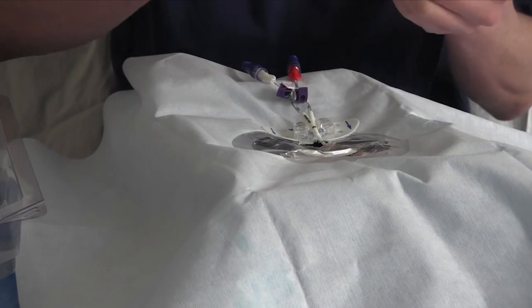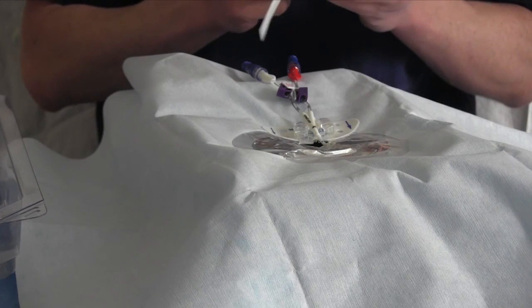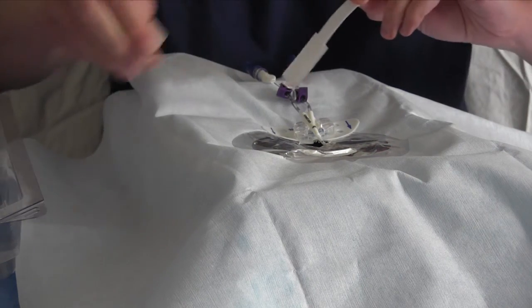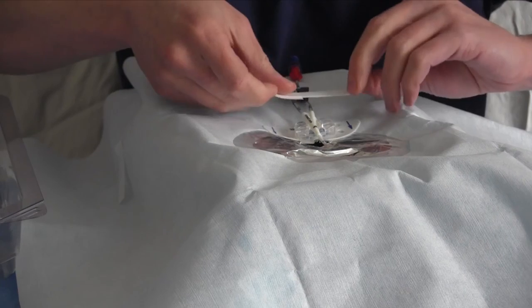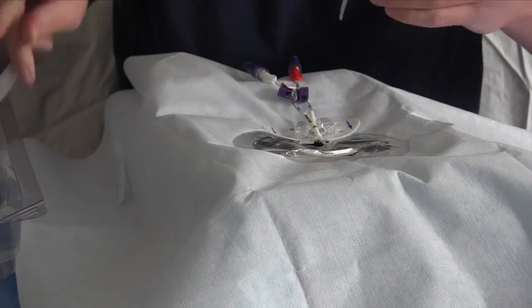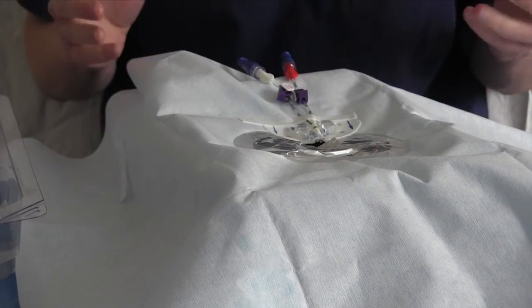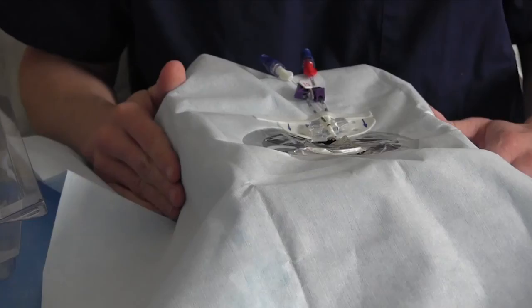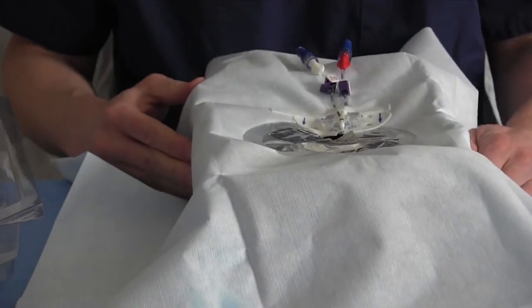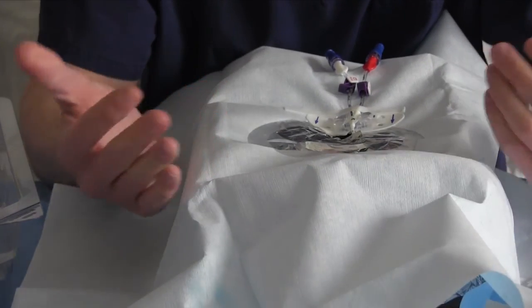And now the secondary securement, you can put wherever you like. I generally will put it right here, right behind that StatLock. And that gives some tension release. Now, what this set doesn't have that we need at our hospital is a BioPatch. So you have to get those separately. It's kind of annoying, but that's what we're dealing with.